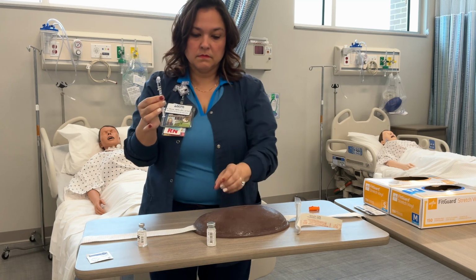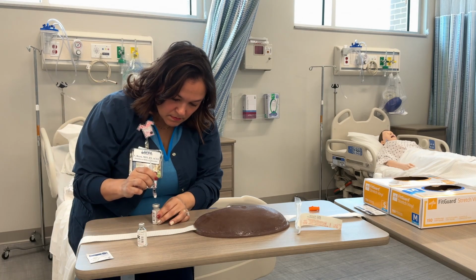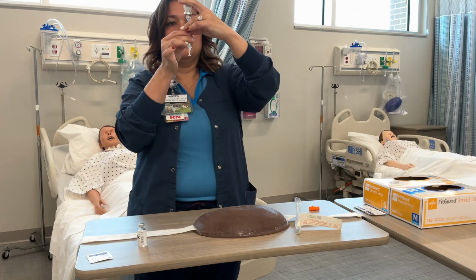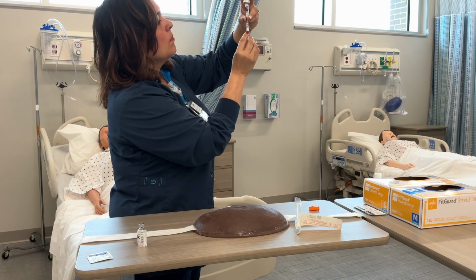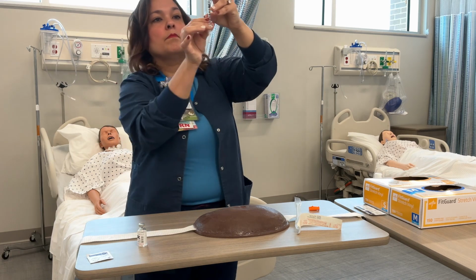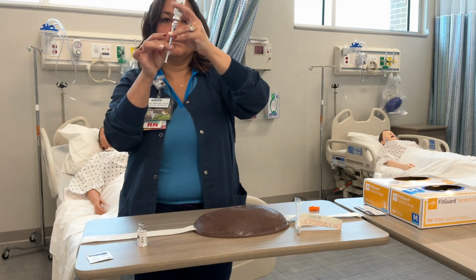All right, so we're going to draw the needle, and now we're going to go into our intermediate acting insulin vial, being very careful not to inject anything into it, because remember, we have regular insulin in there. So we're going to pull up 10. Now this one, you can't move this around. You have to get it the first time because you can't put any of that regular insulin in. So she should have 20 in there. I'm going to verify. Absolutely.